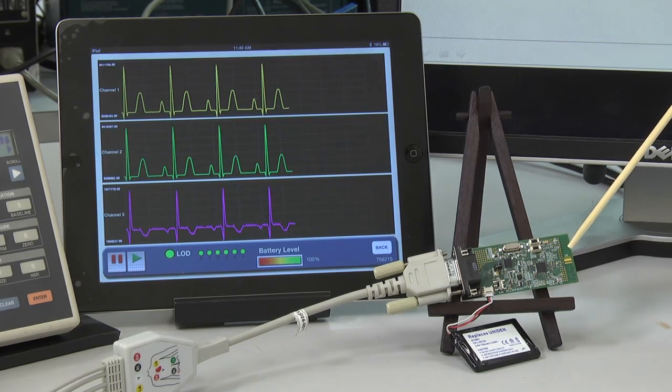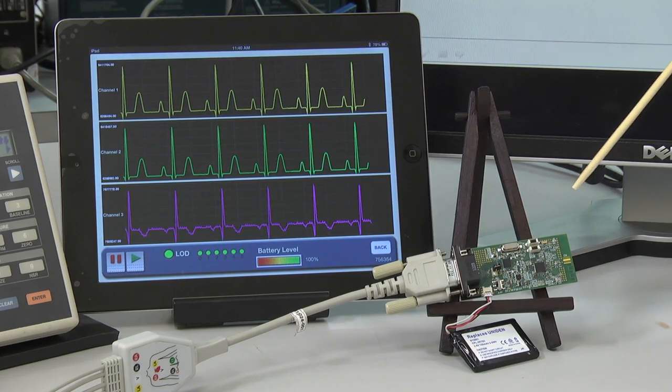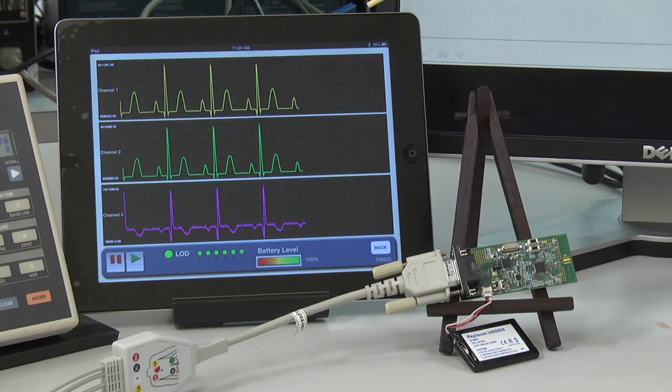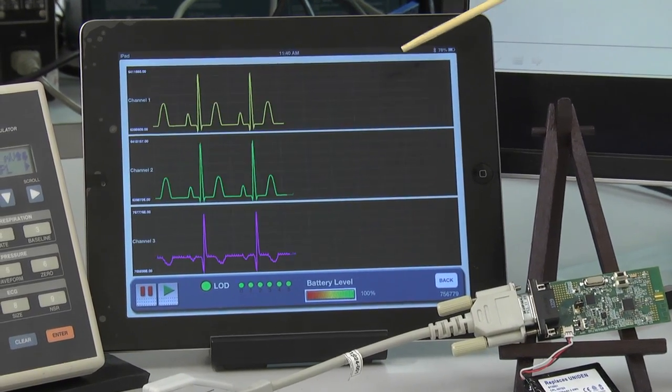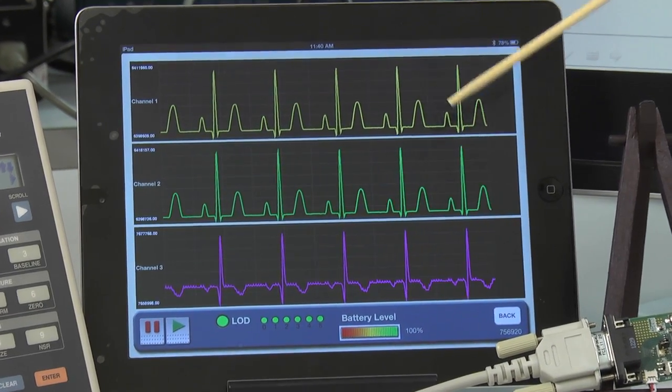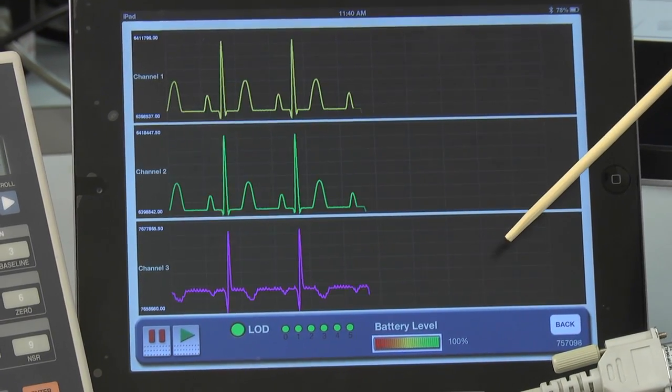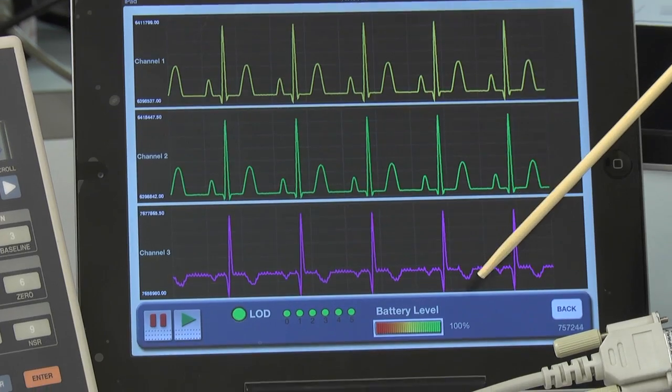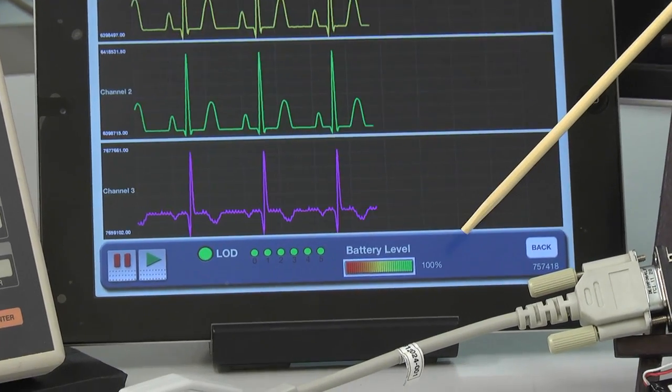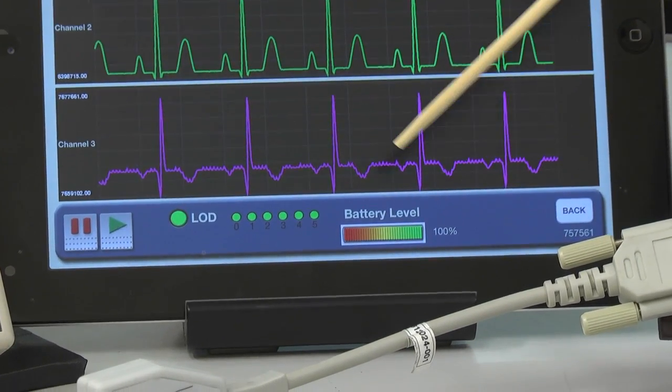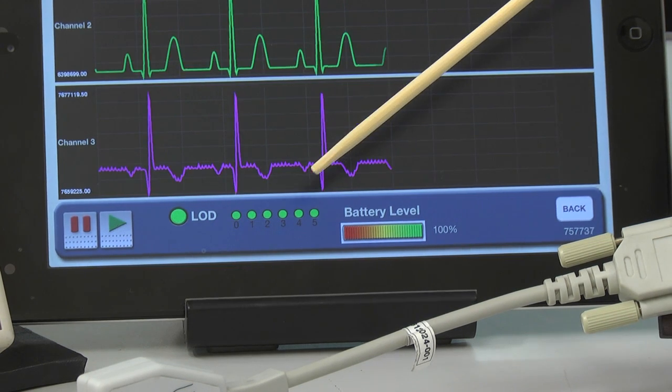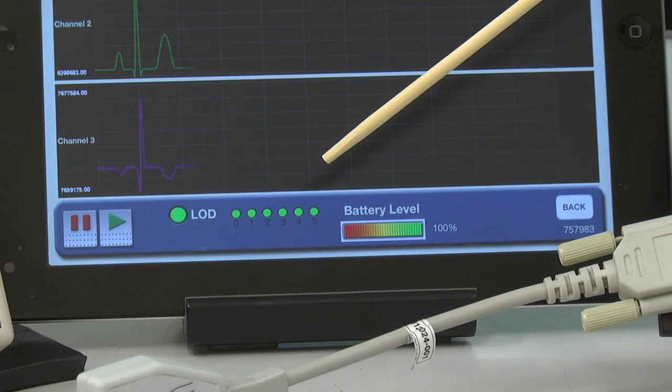So this data is transferred wirelessly and is displayed using this iPad. It's a three-channel demo, so you can see here is channel 1, channel 2, and channel 3. At the bottom of the iPad is a battery level that tells you how long the battery life will last. And to the very left, we have a lead-off detection which will tell you if an electrode has been disconnected.